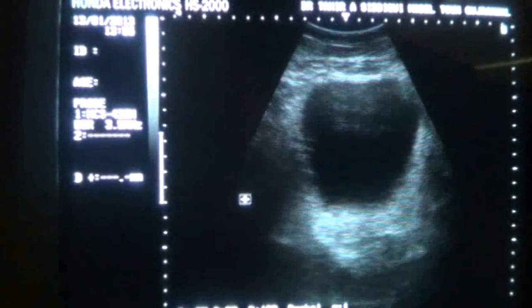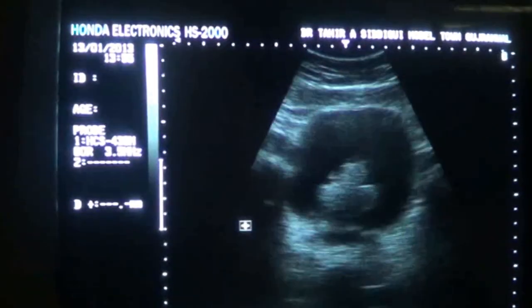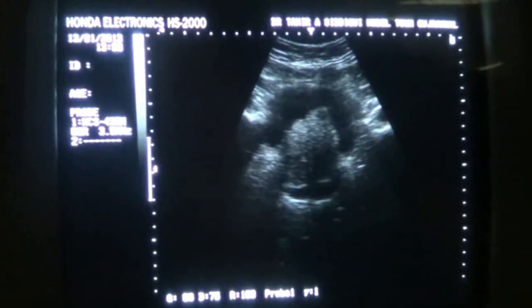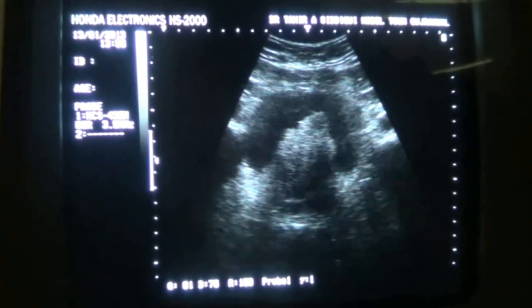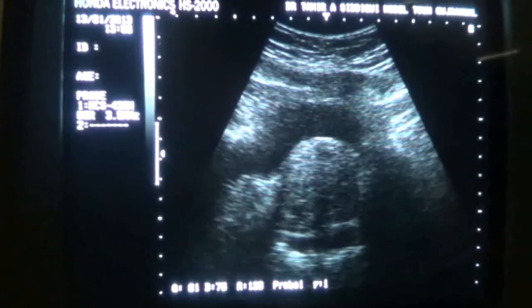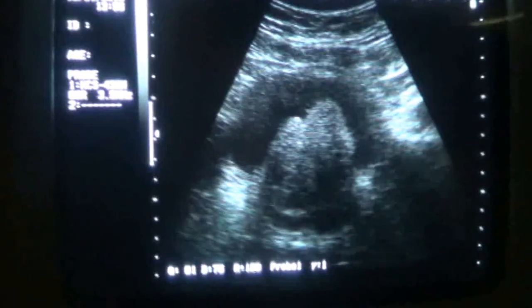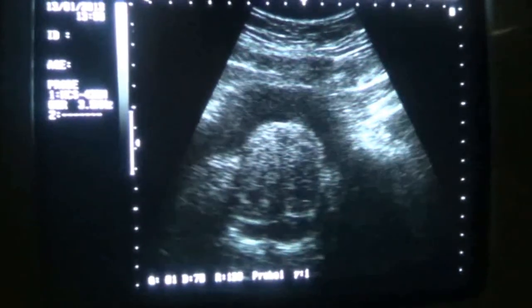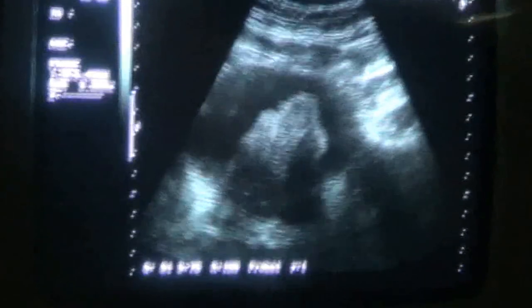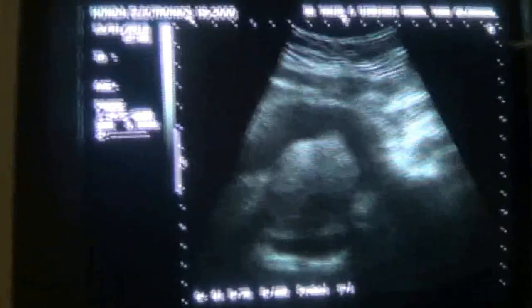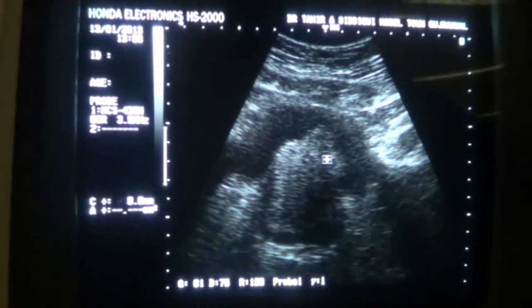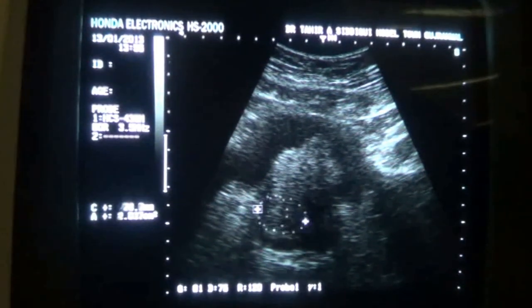When I move the probe a bit posteriorly, this becomes a part of the prostate, as you can see. Slightly maneuvering the probe — this is the prostate now. Moving the probe a bit towards the patient's head, I can see it correlating with the prostate in transverse section. This is the prostate in transverse section.